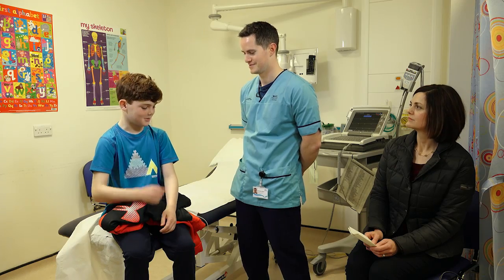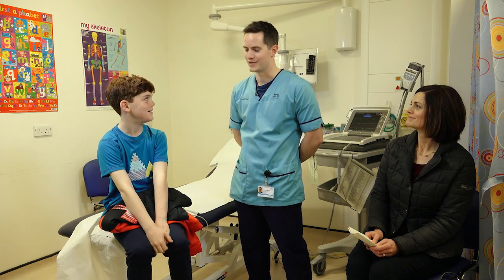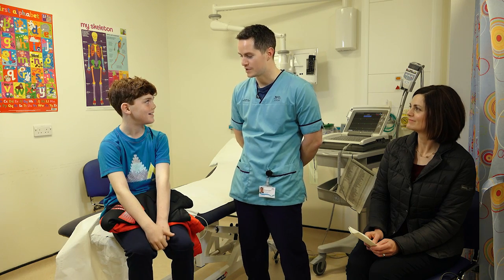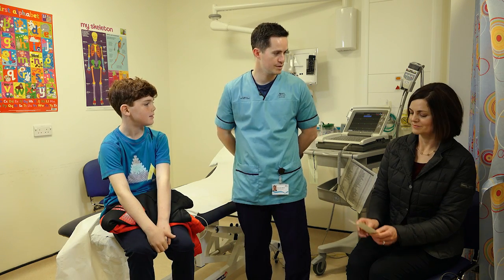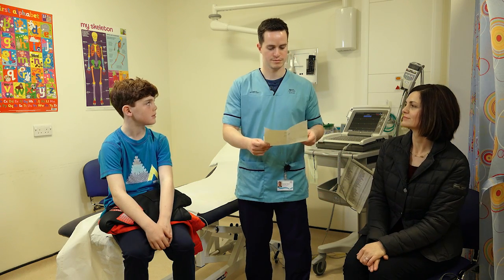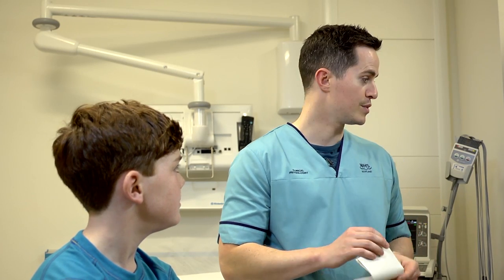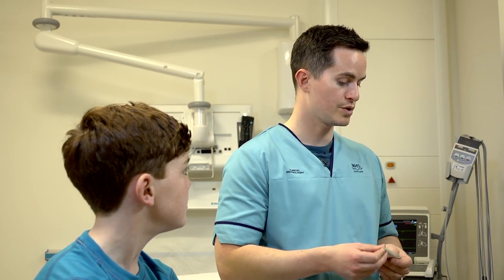Hello again, Sam. So how did you get on with the monitor? Well, one of the stickers fell off, but my mum put it back on. Oh, that's good. Were you able to fill in the diary? Did you have any symptoms? Excellent, thank you for filling that out. So what will happen now is we will analyse the tape and send the results back to the doctor who requested it.